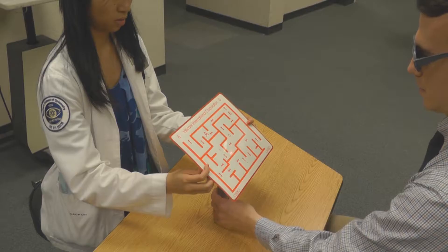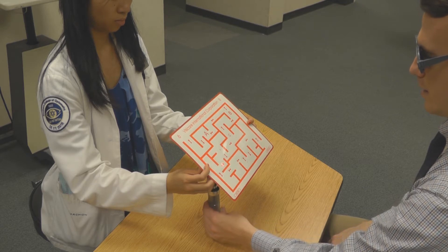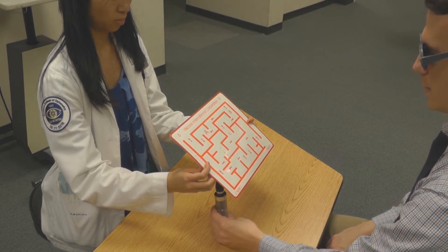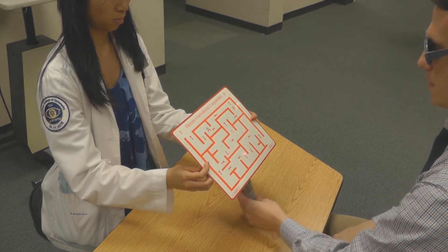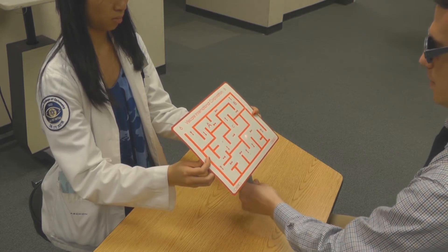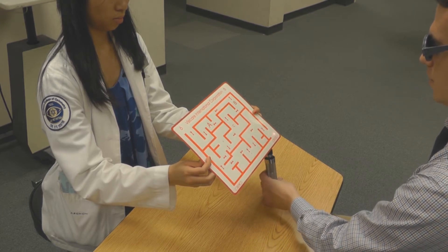This procedure is called the Brock posture board, and here we're going to see it being used as a vision therapy procedure. The doctor or therapist to the left is holding the board, while the patient who's wearing the red-green glasses is holding a transilluminator on the bottom surface of the Brock posture board itself. The patient is moving the light, and we'll see that in the direct view which comes up next.